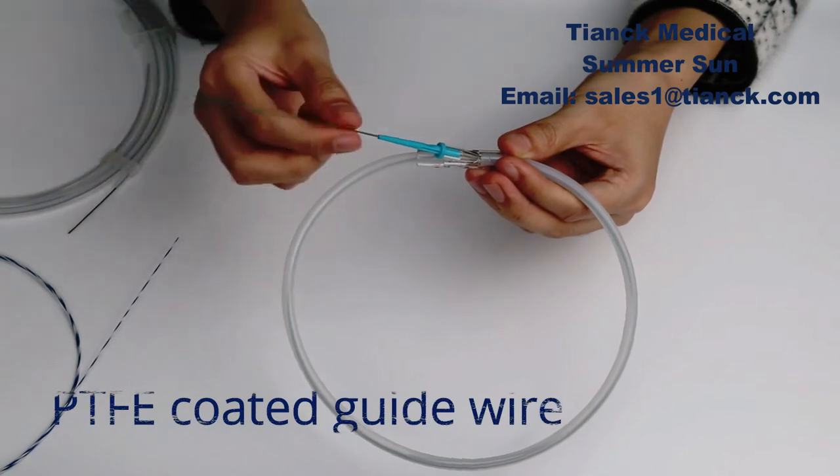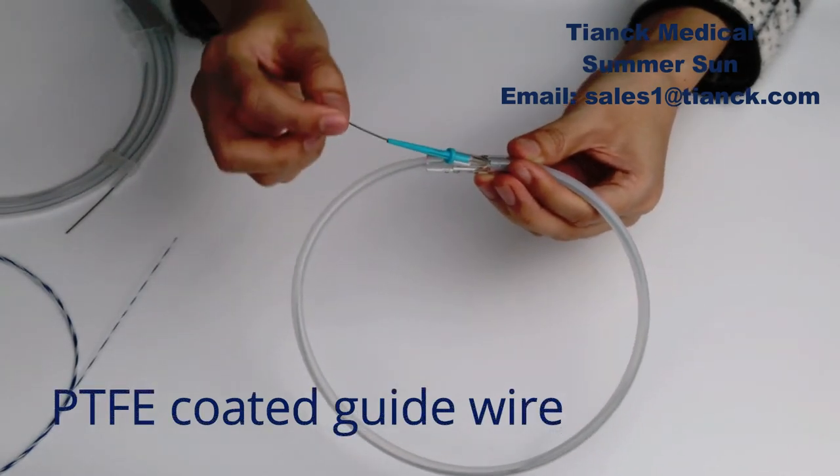PTFE coating guide wire is PTFE coating over the entire wire surface for smooth, increased lubricity, and trackability.